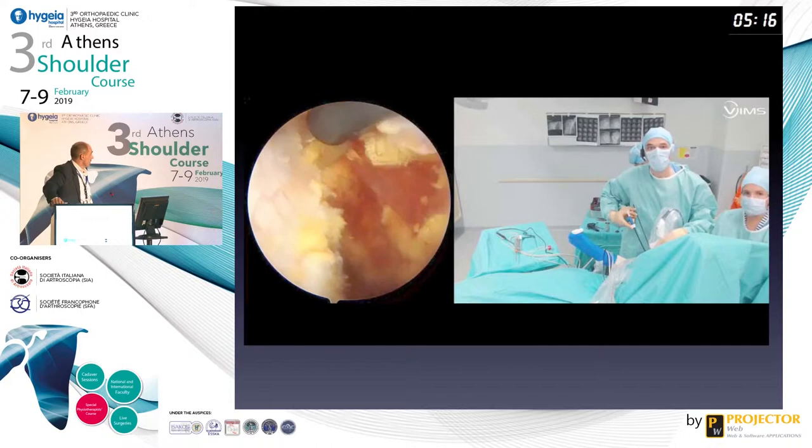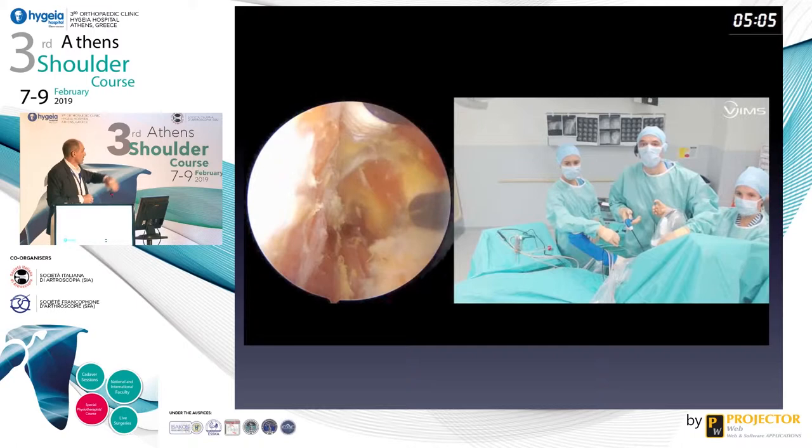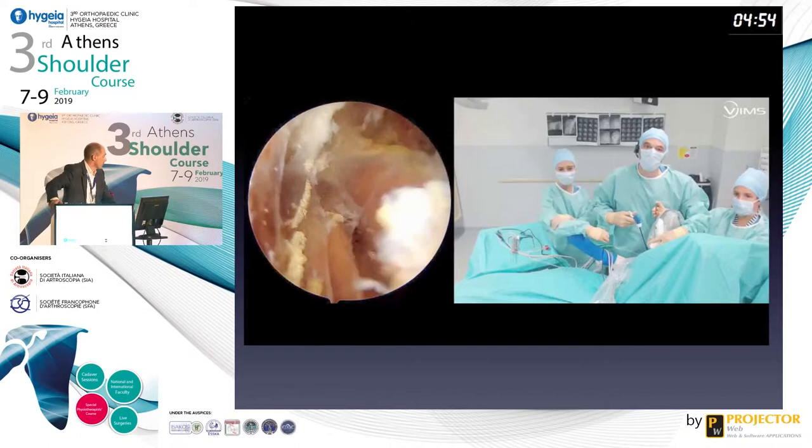But you can go to the scapula, and then you can see here with my scissors, it's very easy to retract with one retractor. Of course, you pull with your sutures, and you can mobilize your transfer exactly as if you were in an open surgery. And you have to go as deep as possible.